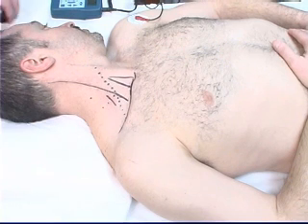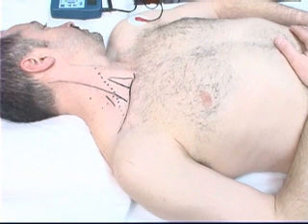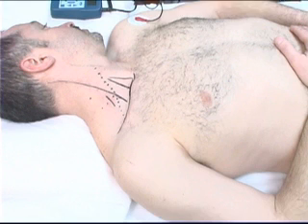All the nerves in the posterior triangle of the neck can be mapped percutaneously using a special probe or with the tip of the needle. The nerve stimulator is typically set to 5 to 10 milliamps for this nerve mapping. The operator stands at the head of the table facing the feet of the patient.